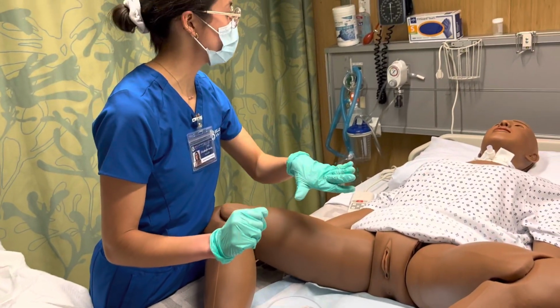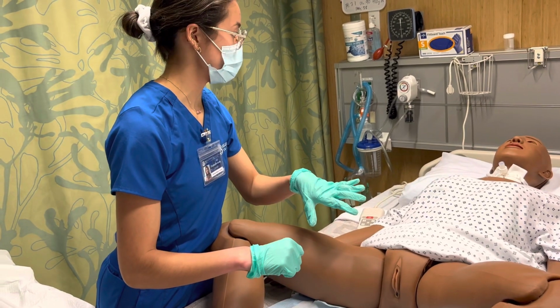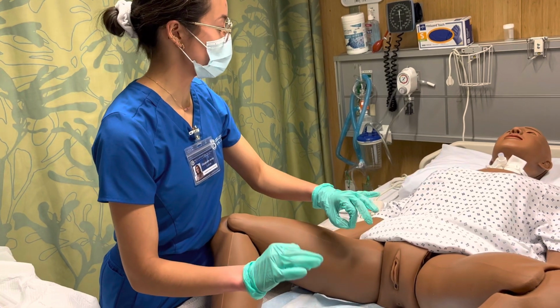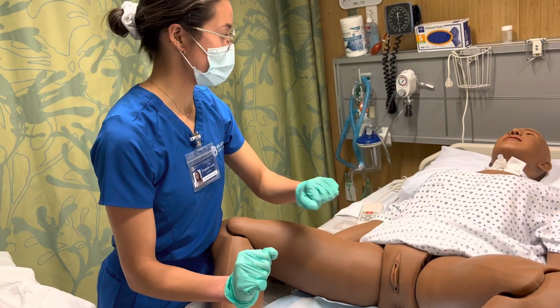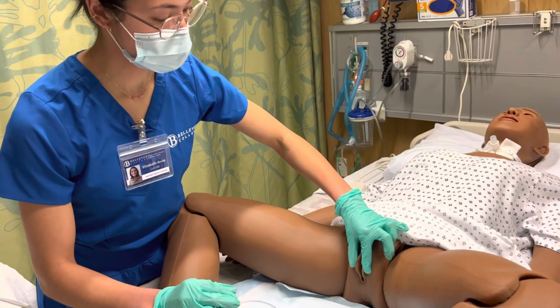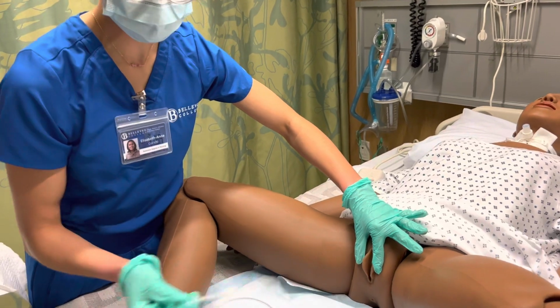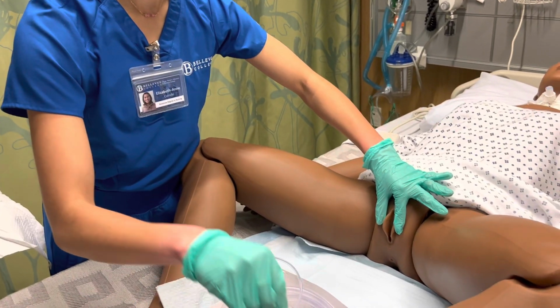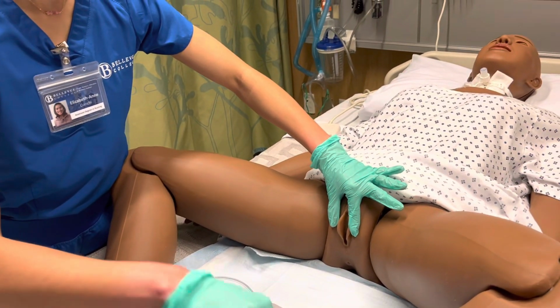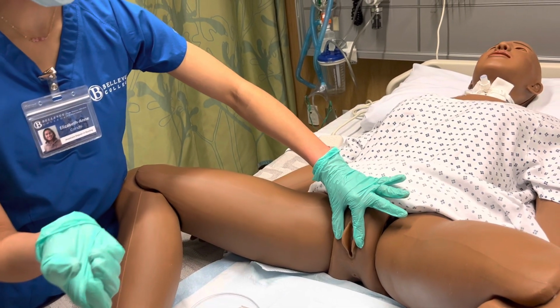Alrighty, so you're going to feel me clean first, and then we're going to do the insertion, okay? At the point of insertion, if you can just bear down a little bit so that it can make the meatus a little easier to see for myself. Alright, here are my hands. I'm going to spread. We're going to do one wipe down one side and toss. One wipe down the other side and toss. One wipe down the middle and toss.